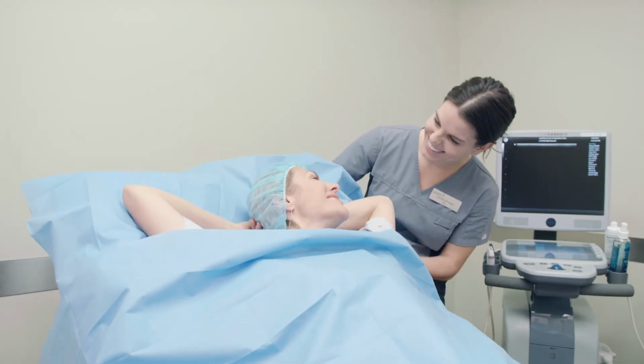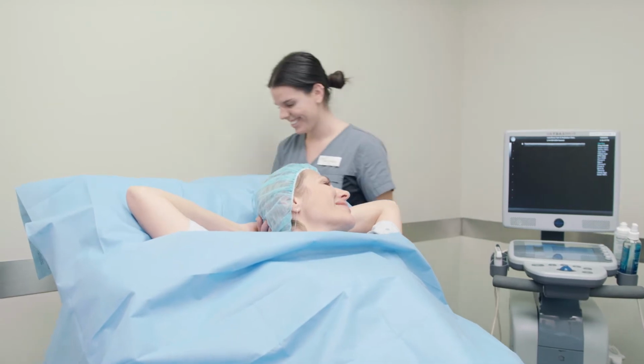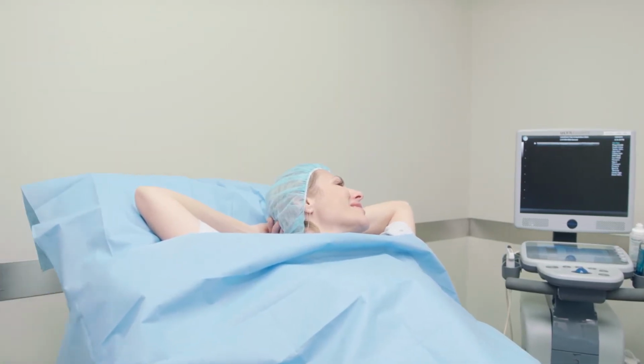Once your legs have been cleaned, our assistant will position you on the bed, either on your back with your legs fanned open or on your tummy, depending on the vein we're accessing. If you're positioned on your back with your legs fanned open, we will have you turn onto your side. We have pillows to prop and hold you up. We will make sure that you're comfortable, so if there's anything that you need us to do to adjust your position, we will do that for you, so that you're comfortable for the entire 60 to 90 minutes during the procedure. After that, our lead nurse will enter the room.